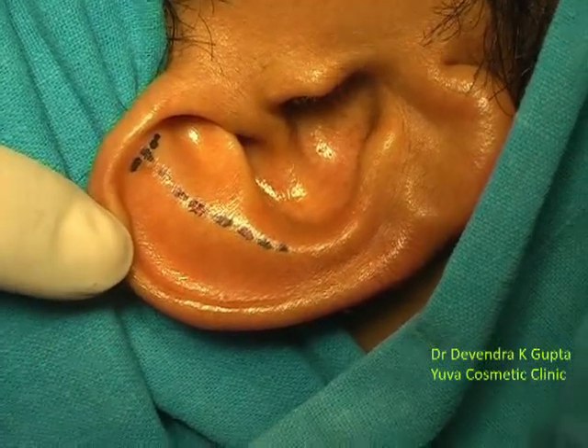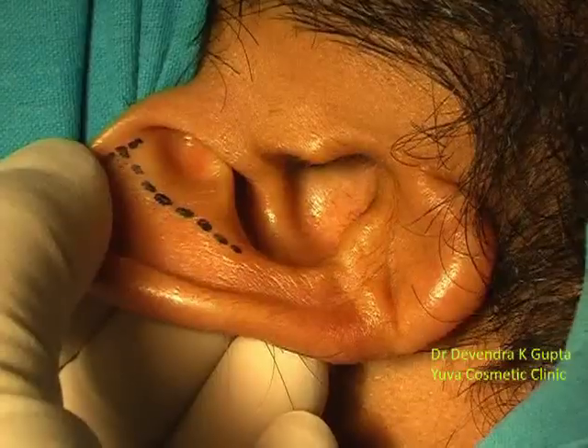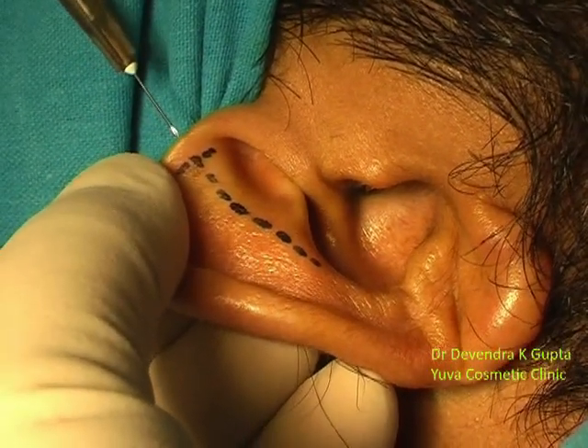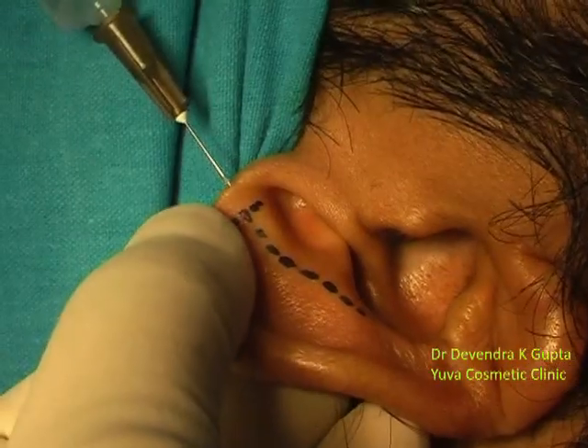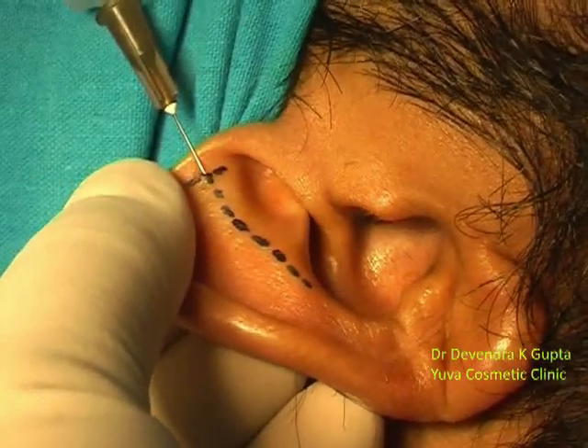The same detailed procedure is repeated on the other side also — the incision line, with the help of local anesthetic solution. I have not mixed adrenaline here.